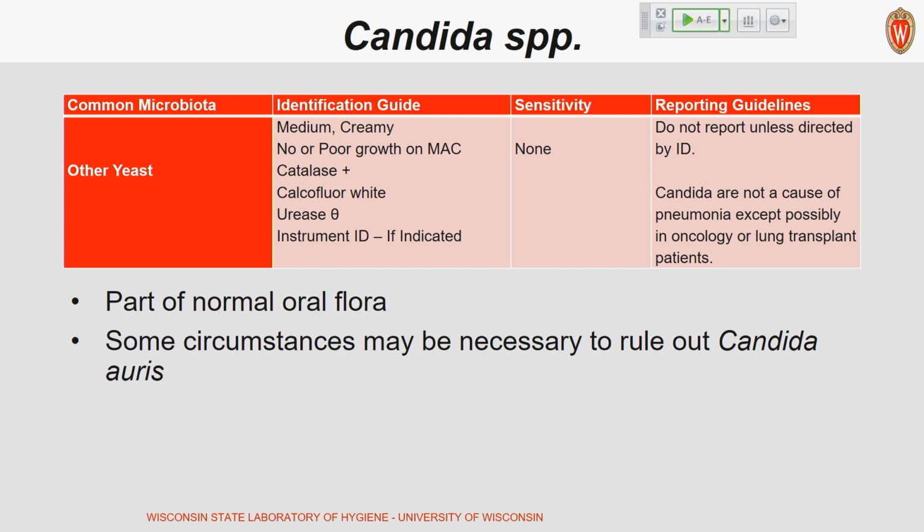So again, Candida being part of the normal flora, and it is worth noting there are some circumstances where ID or infection prevention may find it necessary to rule out Candida auris, which is obviously an emergent pathogen.